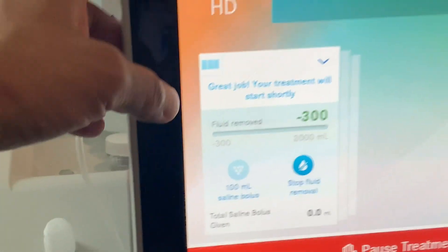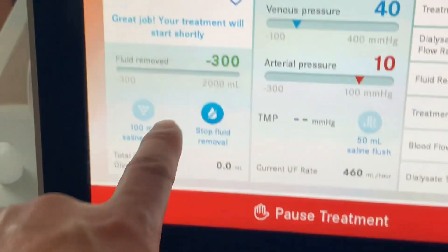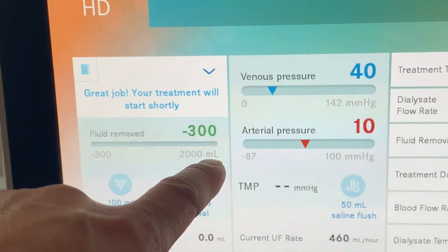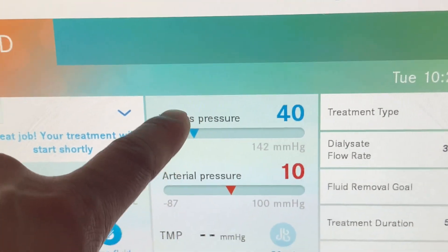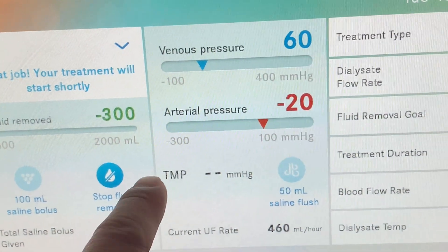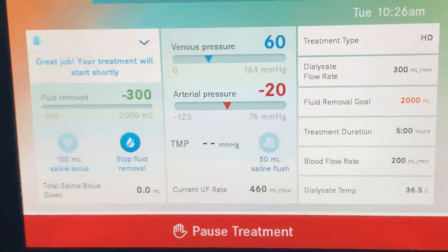At this point you can click on here and it'll give you the pressures. So what we take note of: the 300 is what we prime the line with, so we're going to start with a negative 300 here. As we remove fluid out of the patient, this becomes a positive number, and this is the actual fluid that we've removed. Our goal today is two liters. We want to take note of the venous pressure, the arterial pressure, the TMP — which takes a while once blood is running in the actual circuit to start showing a number. We also note our dialysate flow rate, our treatment goal, and blood flow rate. And that is it.